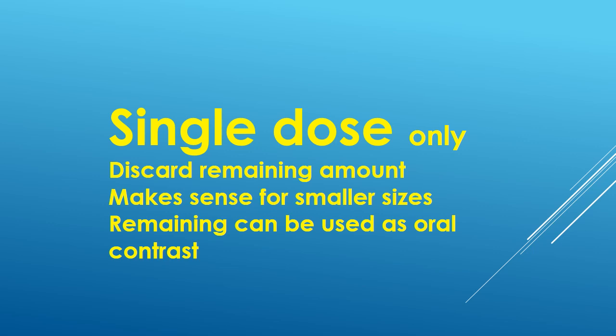I don't mind the use of this leftover contrast media as oral contrast. So you can use this contrast media as oral contrast, and that also within the same day. It should not be used for the next day.